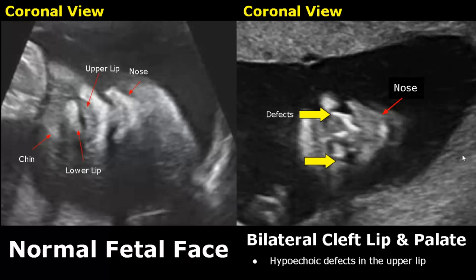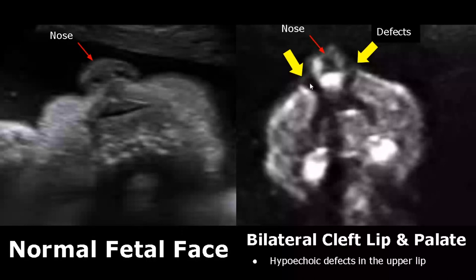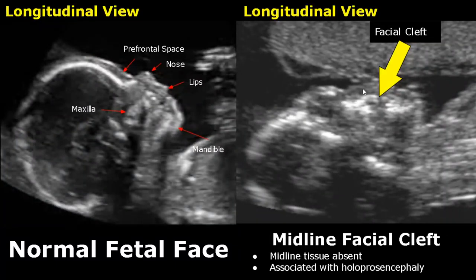In this image, we can see the bilateral clefts more clearly. The hypoechoic defects are communicating with the palate. Midline facial cleft is associated with holoprosencephaly. The face is deformed and there is absence of normal midline tissue.